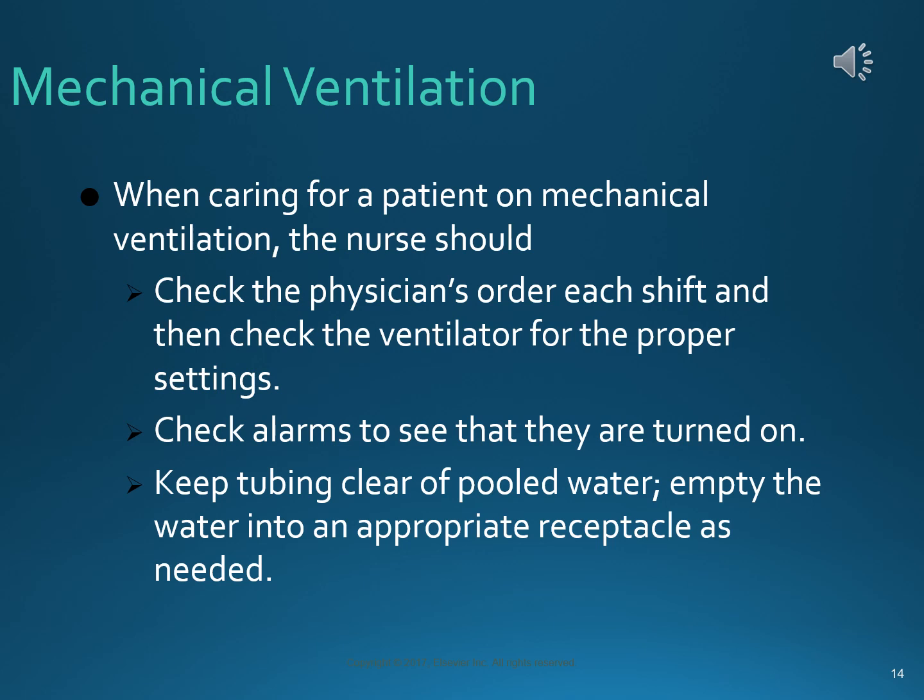So this is just a few more nursing care things. Some of it's common sense, actually. Of course, checking the order every shift and then checking the ventilator for the proper settings. You may think this is a respiratory thing, and it really is kind of a respiratory thing, but stuff in those rooms gets bumped, and people push buttons and change things, and they don't push them back. So it's just a good idea to make sure when you get there that things are doing what they are ordered to be doing. Always check to make sure your alarms are turned on.